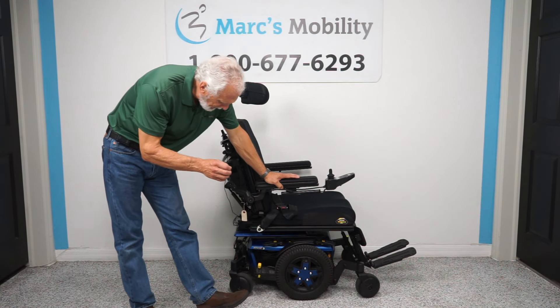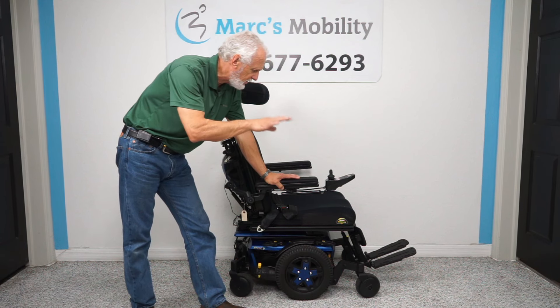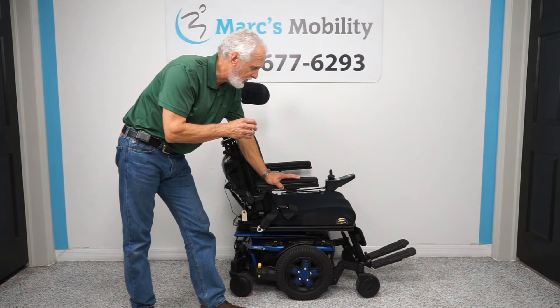We have here what's called a Quantum Edge 3 power chair. This power chair has the electric tilt only, so it's a Quantum Edge, and it has 493 miles, so it was used for about a year and a half.